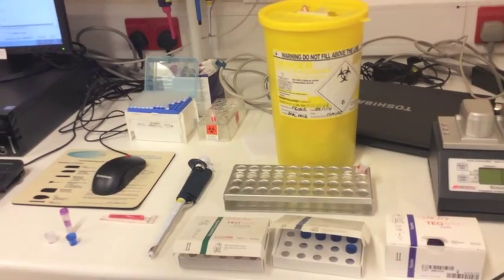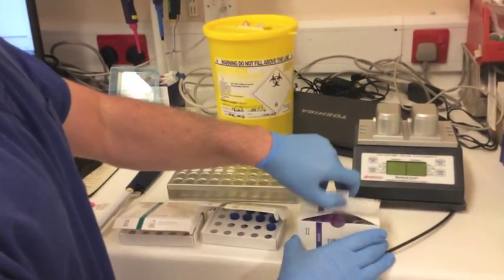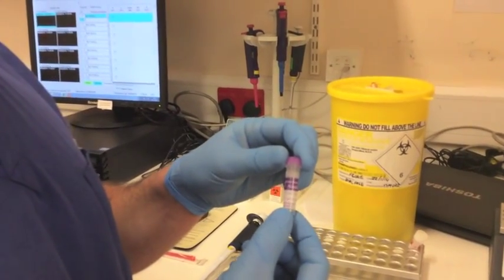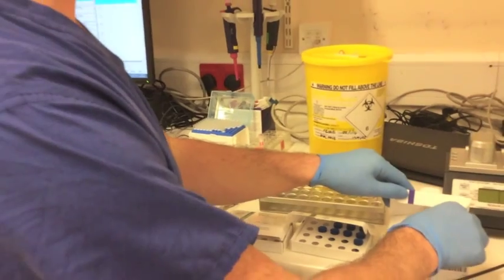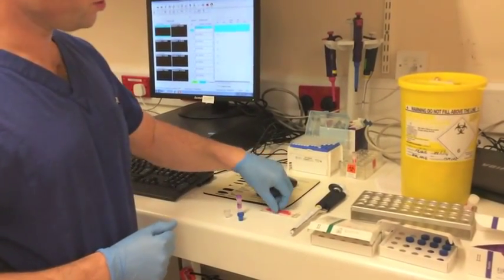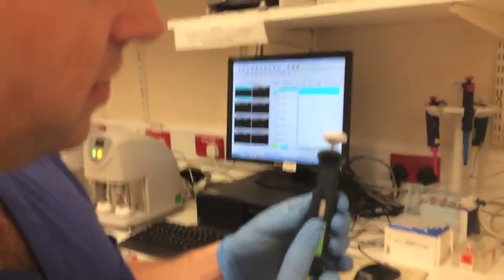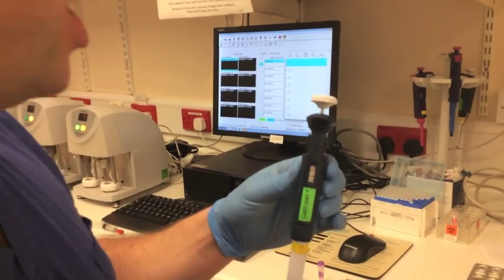They will often be found stored in the fridge. For a standard TEG we also use a kaolin sample, which is an activator used to activate the coagulation process. So you need your cups, your kaolin, your blood sample, you'll also need a drawing-up needle, and you'll need a pipette. The pipette will need to be calibrated and set to allow you to have 360 microlitres of blood in each cup.